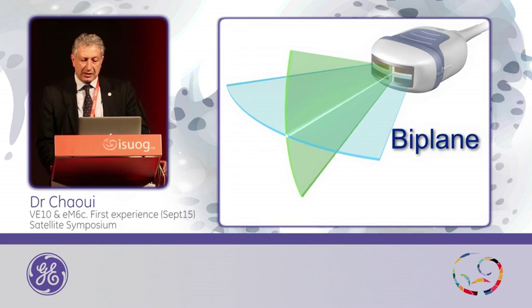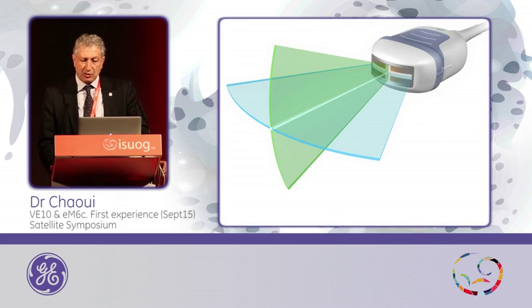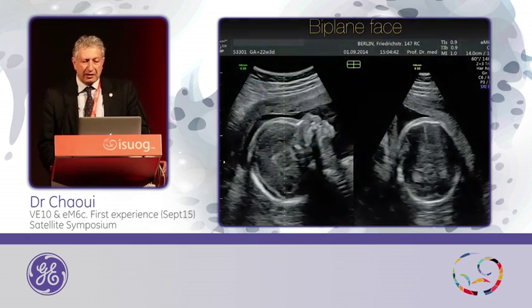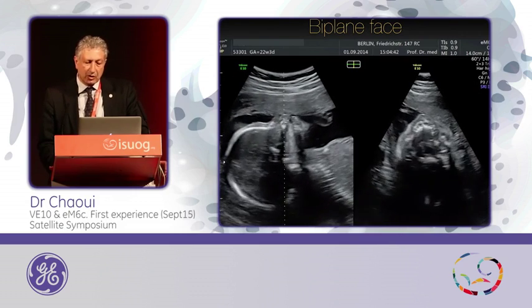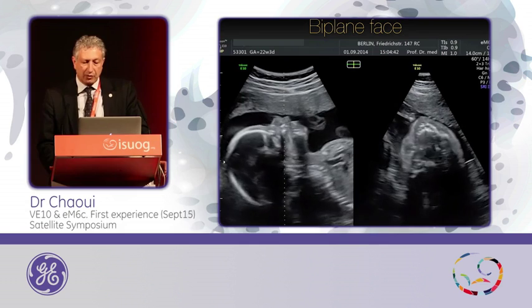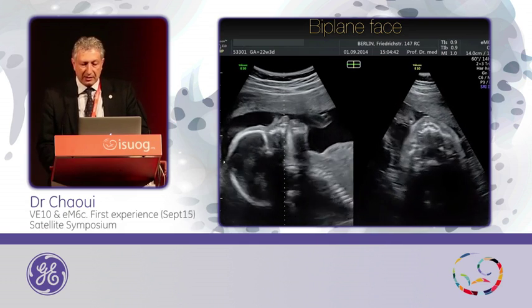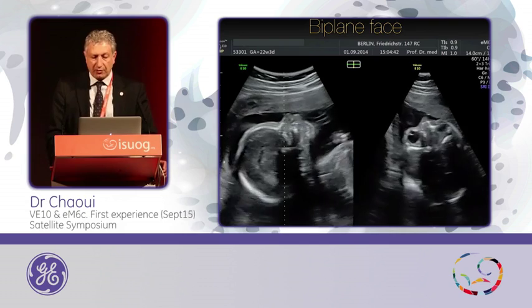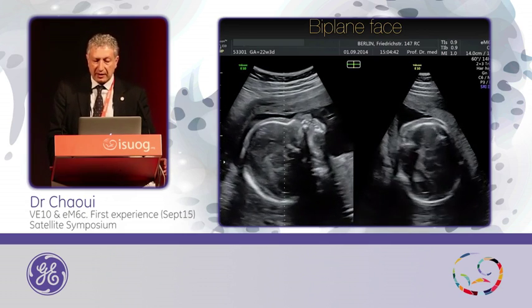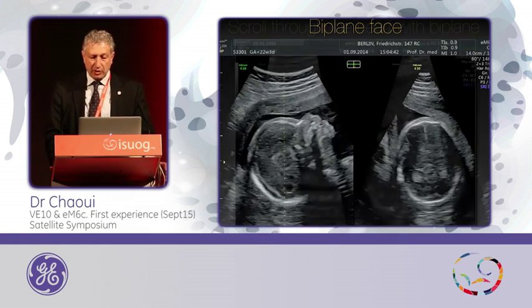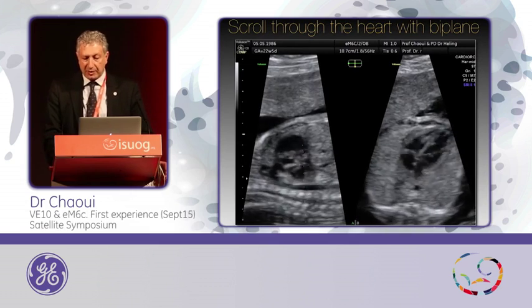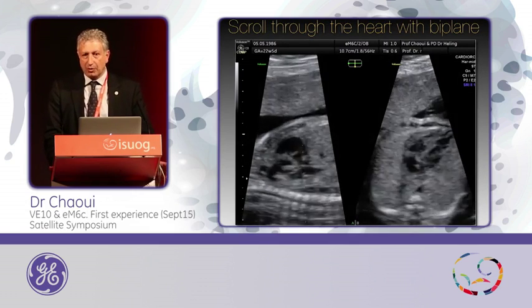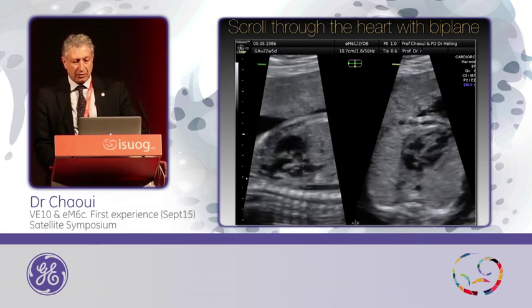An exciting tool is the biplane, where in addition to the plane you are scanning, you can have an orthogonal plane. Some people think, 'Do I really need this?' But once you start using this technique, you will get used to it because you will have a look at the same time at the profile, and here you see the palate. You can get a cross-section of the eyes. By getting a longitudinal view, you can take the line and scroll up and down from the 4-chamber to get the three vessels within a sweep while looking at the non-moving baby.